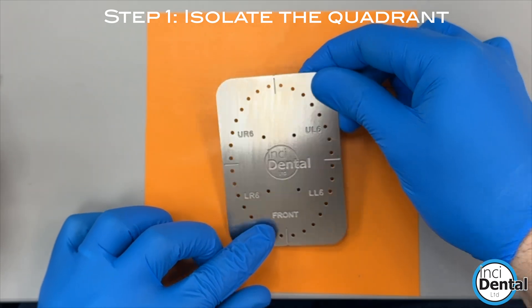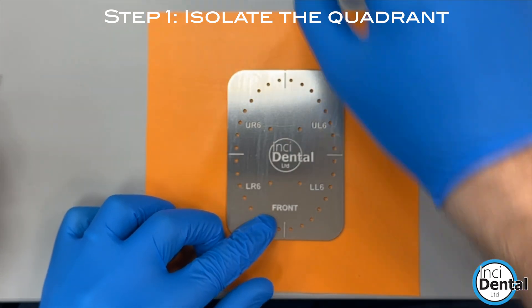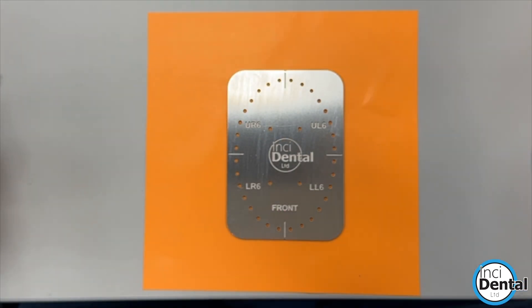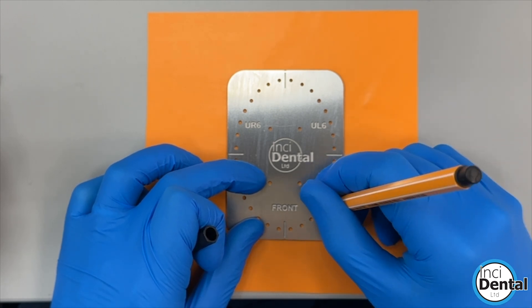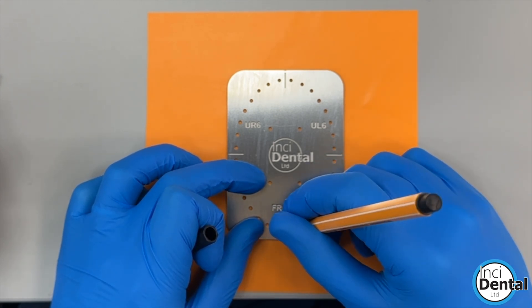Step one is to isolate the arch. Here we're doing the lower left: seven, six, five, four, three, two, one.